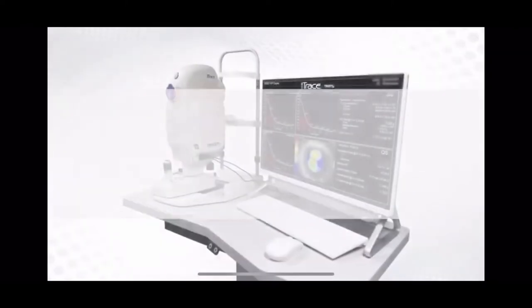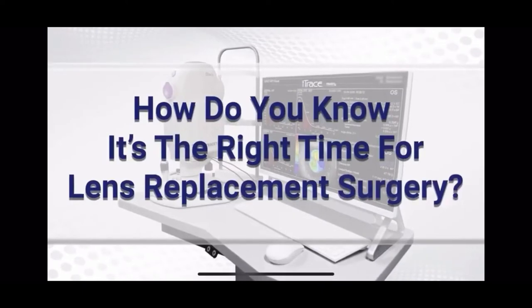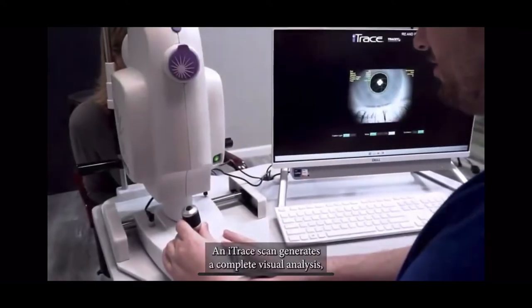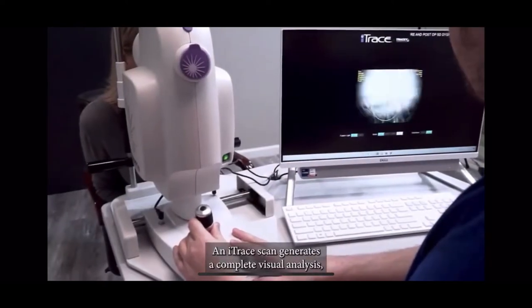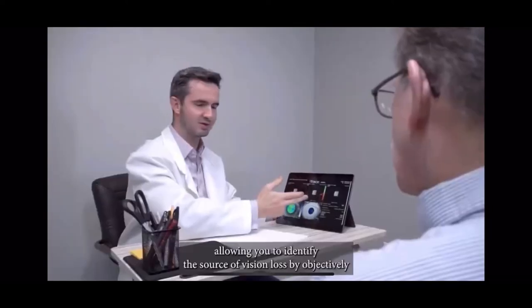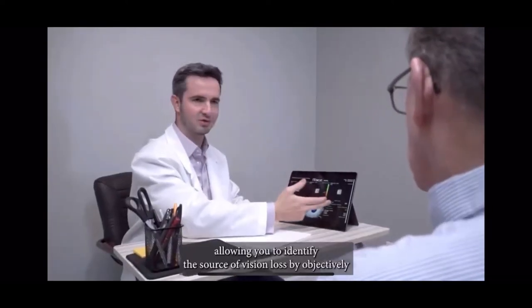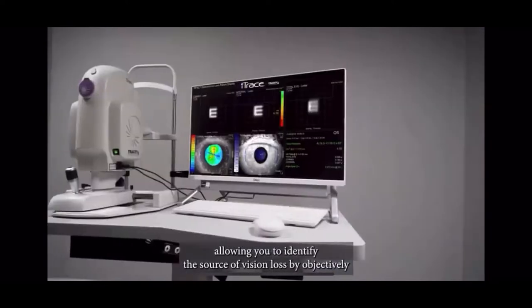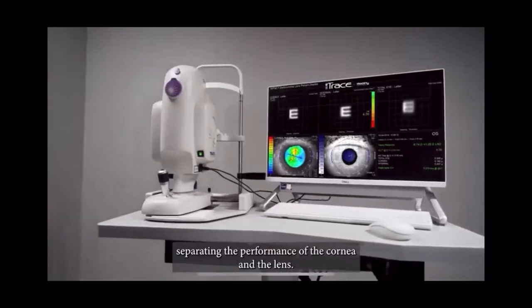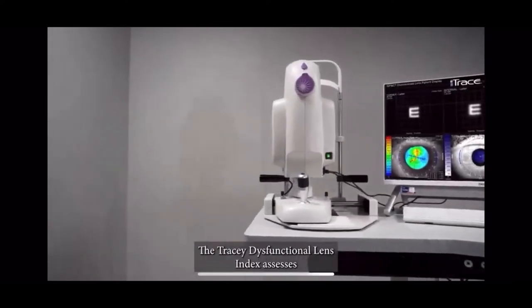How do you know when it's the right time to perform a lens replacement surgery? An iTrace scan generates a complete visual analysis, allowing you to identify the source of vision loss by objectively separating the performance of the cornea and the lens.